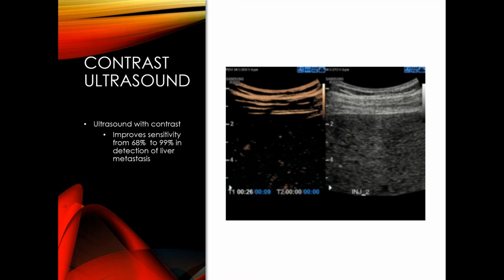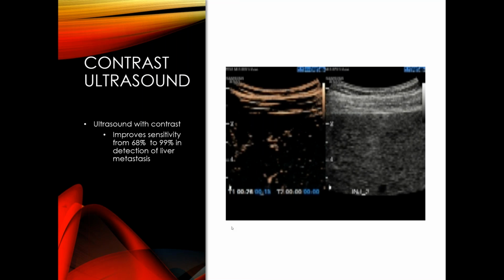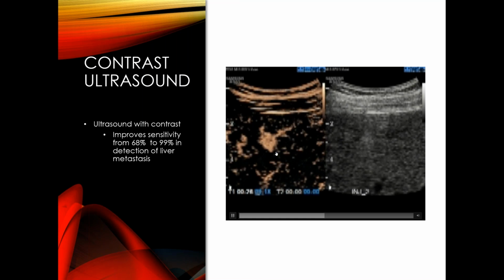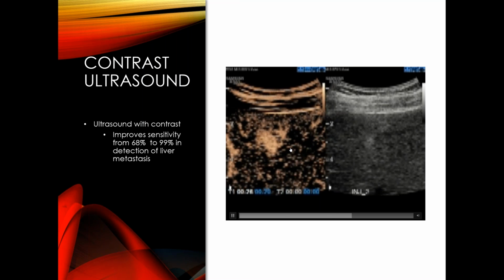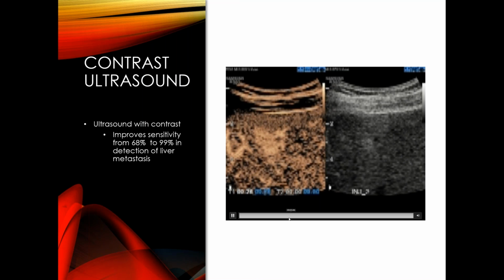But there are certain types of ultrasound machines called contrast ultrasound that we can do, and we do that here in Calgary at Foothills Medical Center, and it's also offered in other academic centers such as Toronto. And this is contrast ultrasound, in which we inject little bubbles and see what the characteristic enhancement of the liver lesion is. So this is an example of contrast ultrasound. You can see the bubbles filling up the lesion, and the pattern is basically telling us that this could be metastasis. Okay.